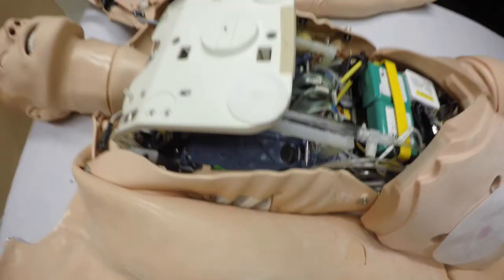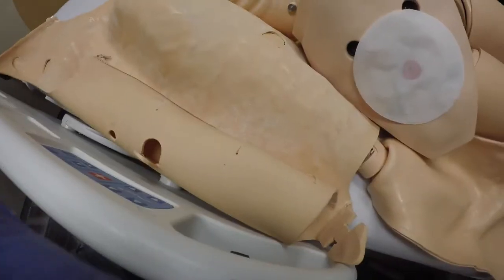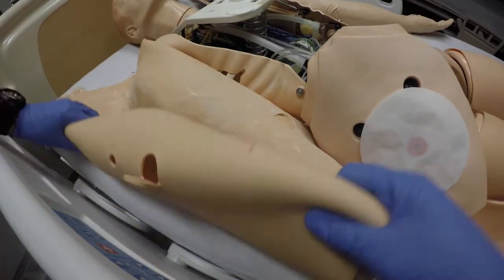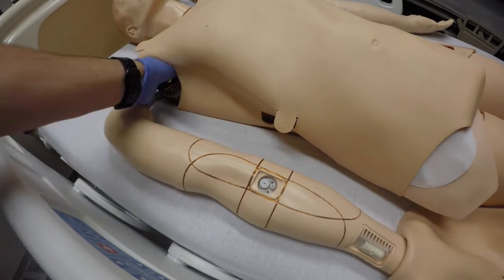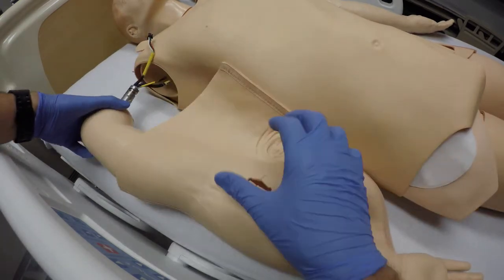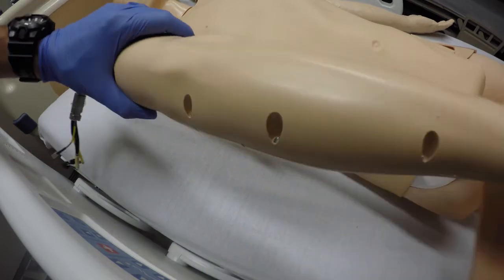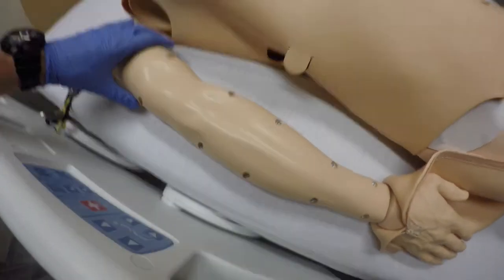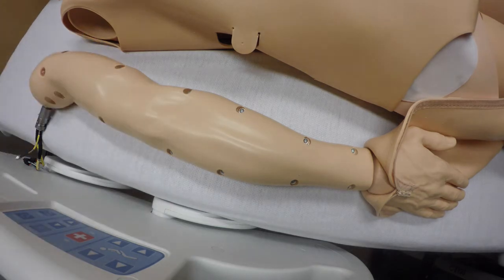Now I'm going to lay the chest plate back down, put the skin back over, and remove the arm. Go ahead and guide the wires out because they can catch sometimes. I've already unzipped the skin and the arm. On the back side, you're either going to have Phillips screws or a Torx size — typically you're going to have Phillips though.